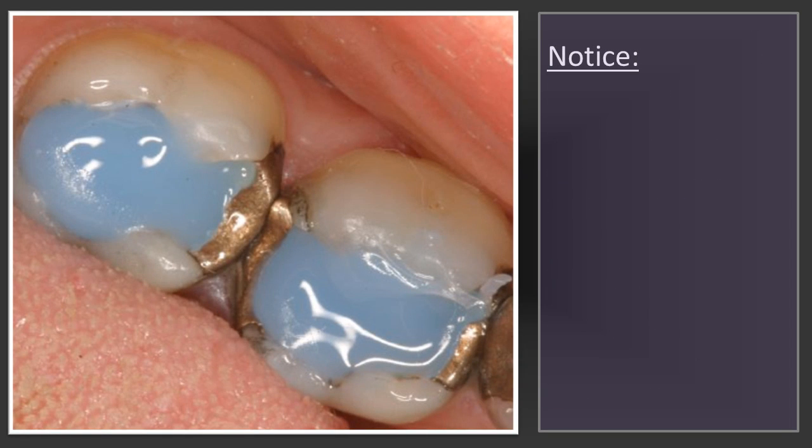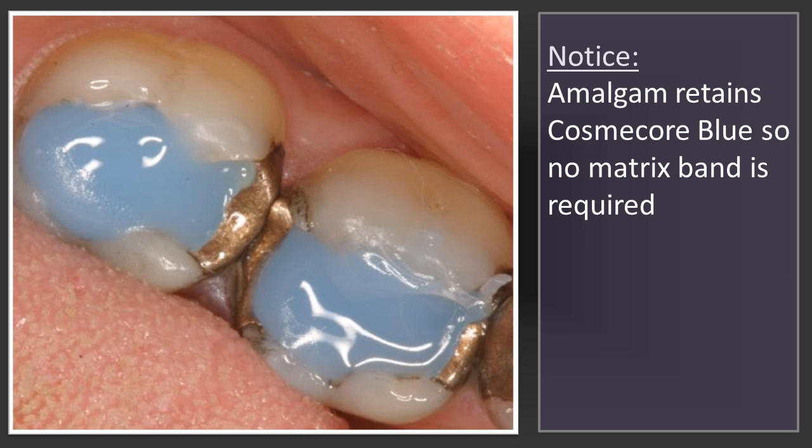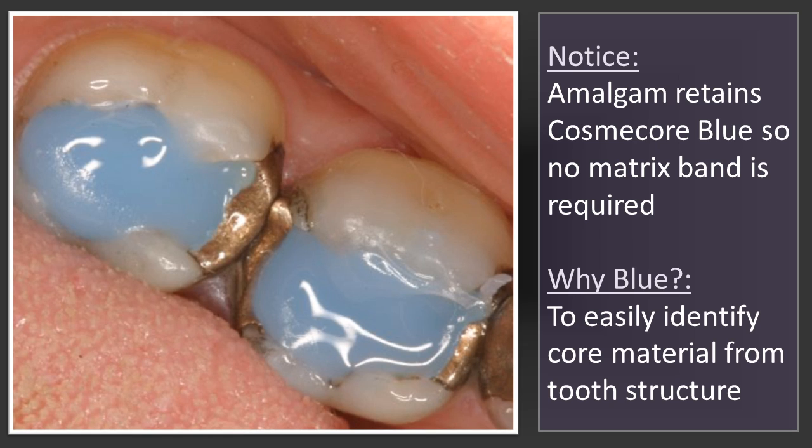As you can see here, I'm using Cosmocore Blue. Blue — why? So when I prep this tooth, I'm able to see where the core material is versus the tooth. If this was going to be an all-ceramic crown, I would use the A2 or the white Cosmocore. But when I'm doing a metal-ceramic crown or a gold crown, I'm going to use the blue so that I can see where my prep is, easier than having to use white or A2.